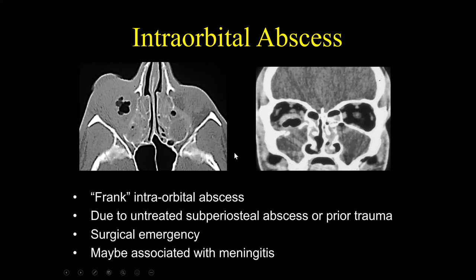This was a case of intraorbital abscess with bilateral mucosal thickening of the maxillary sinuses. I noticed air involving the retrobulbar area, and when I examined all the findings, there was a fracture involving the floor of the orbit. This ended up being an intraorbital abscess that extended from an acutely involved maxillary sinus — a frank intraorbital abscess extending from acute maxillary sinusitis.